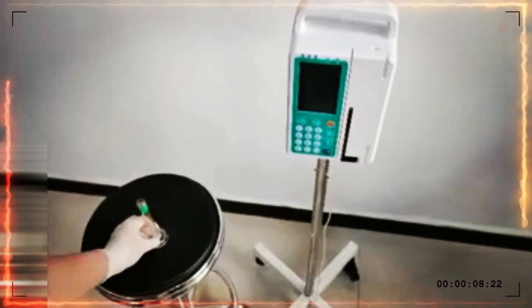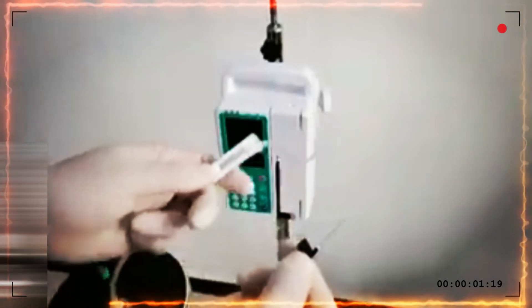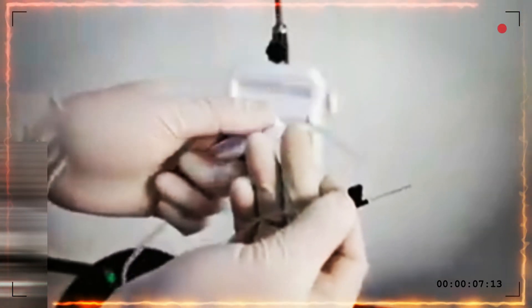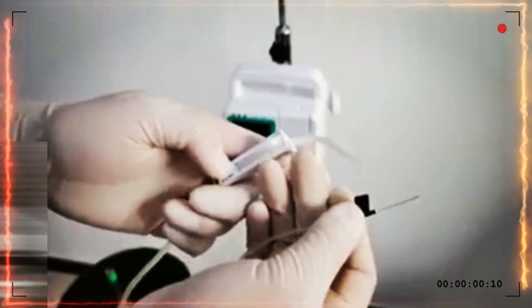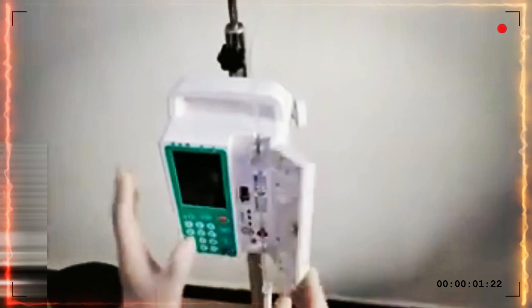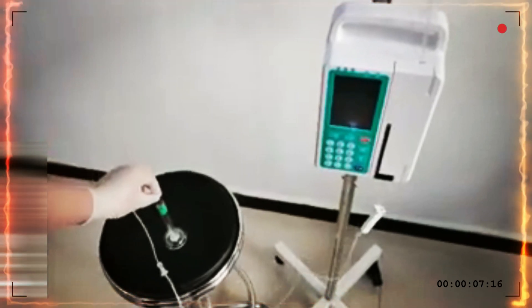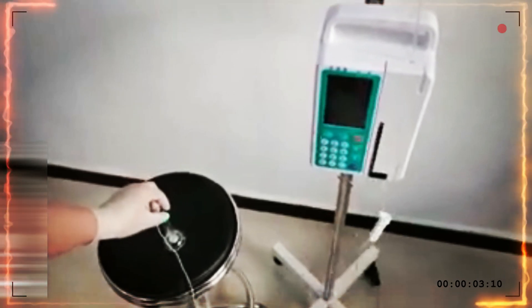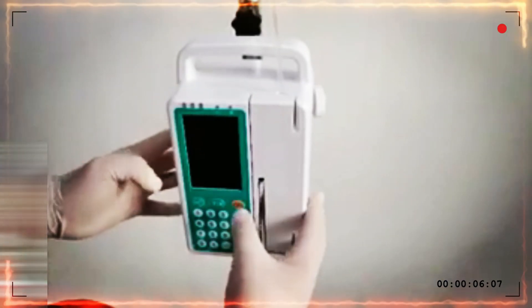Step 1: Empty the cylinder and put it on the surface. Step 2: Fill the IV set with water, then turn off the roller to stop it. Step 3: Install the IV set. Step 4: Put the needle into the cylinder and turn on the roller.